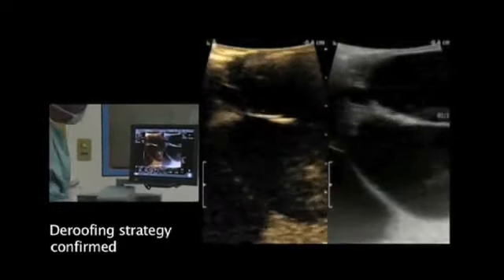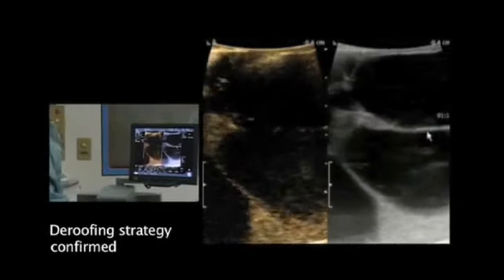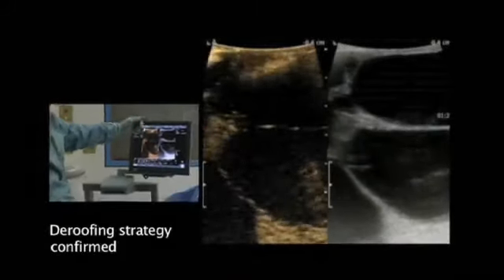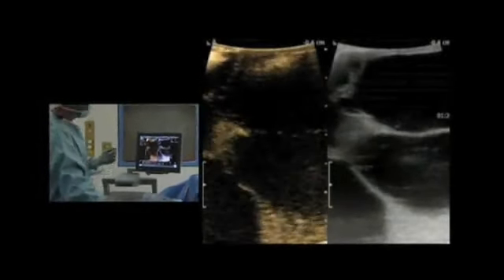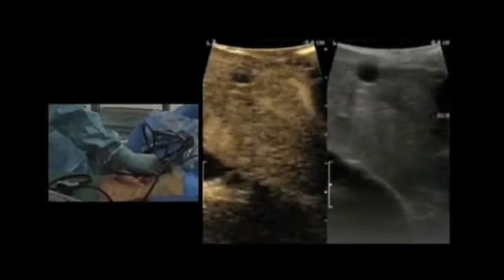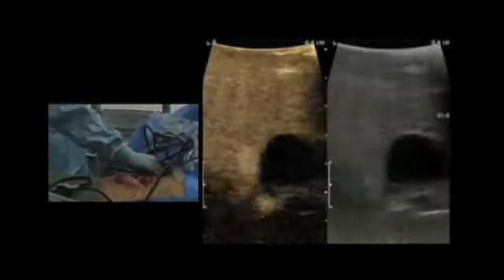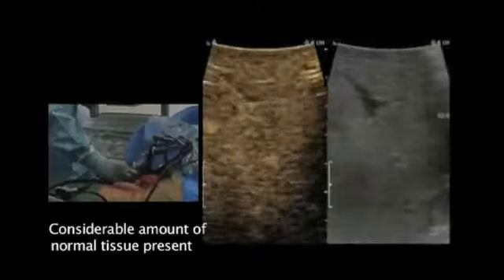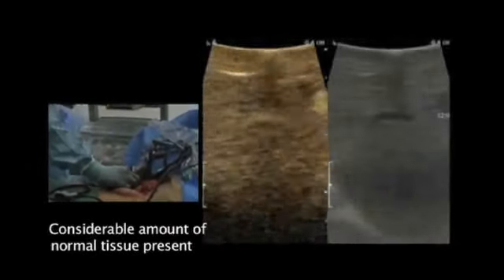So in this area here we can make the de-roofing, and at here that will also be without any larger vessels. I think it is a good way to demonstrate that we can do this in a safe way to fulfill our aim: de-roofing and finding a way through three other cystic volumes until we reach the large dominant cyst in the right liver lobe. Let us go around and see the smaller cysts and if they should hide any solid structures in between in the liver. There is a considerable amount of healthy, normal-looking liver parenchyma, which is good for the patient's prognosis.